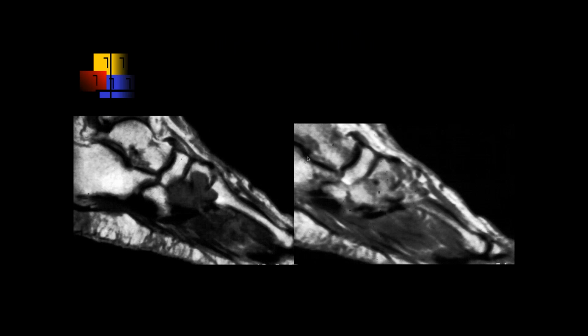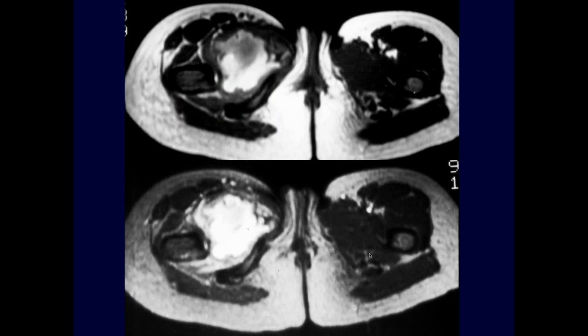Okay, for the next case, a couple of images in sagittal plane, T1 and perhaps T2. So a hypointense mass on the T1s, around the navicular, the cuneiforms, kind of eroding them. Very well-defined margins and appears hyperintense on the T2 images. Not quite sure where to put this, but synovial sarcoma, since you're starting the topic. Yeah, it's near joints, and it turned out to be a synovial sarcoma. And remember, it's 10% of sarcomas, so it's one that you will see. Okay, Dan.